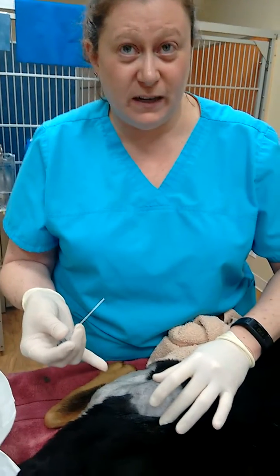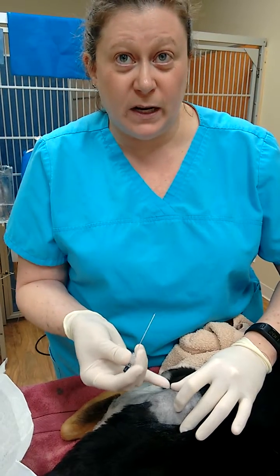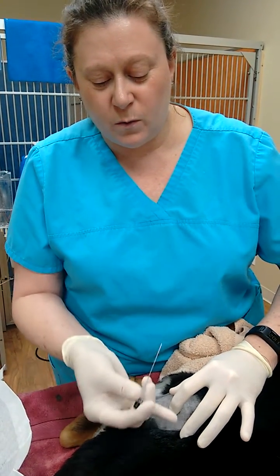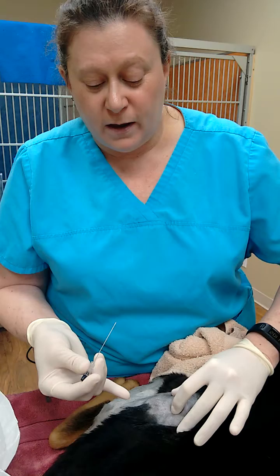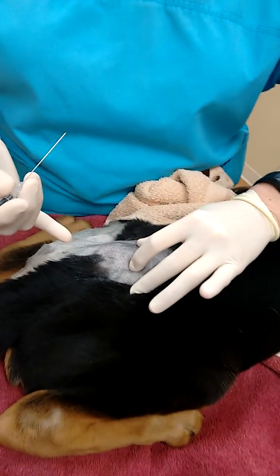He's actually fairly easy because he is kind of bony and skinny. So you find your wing of the ilium, then find the spinous process that's right directly across in line with the ilium. And then you come back and find the divot right here.